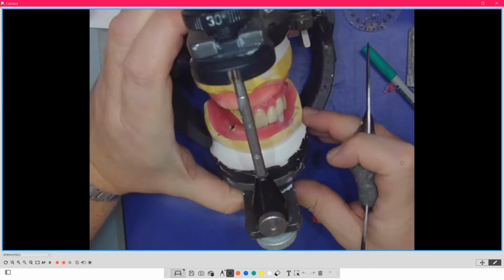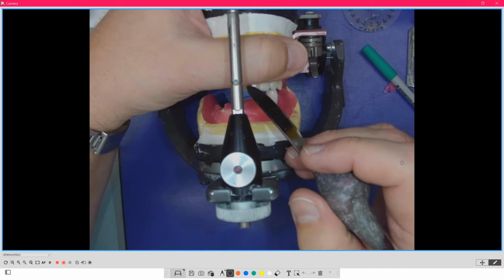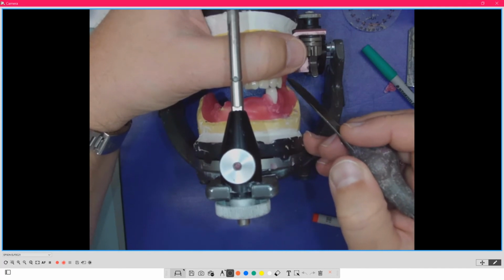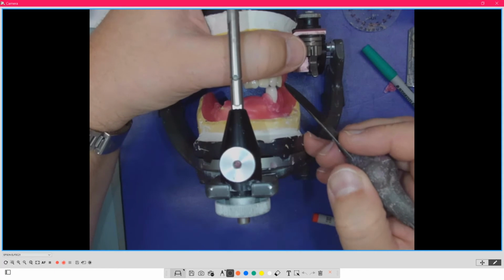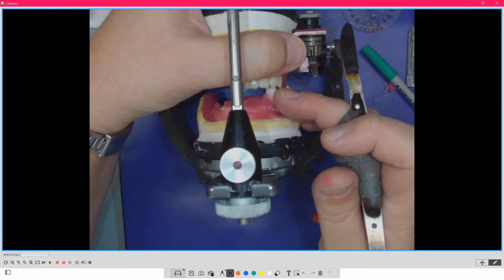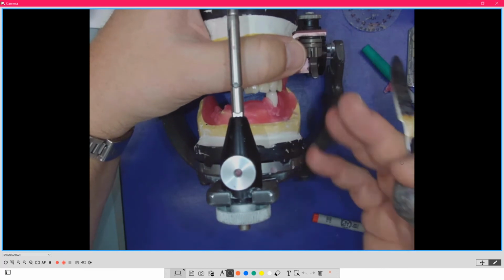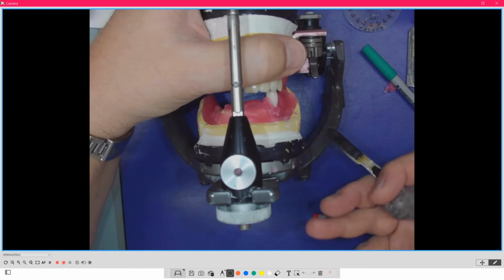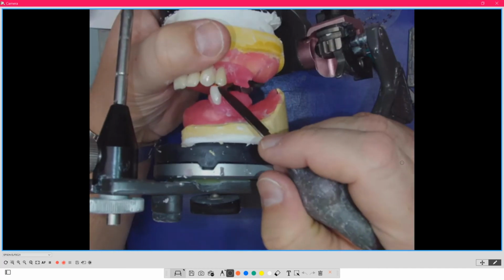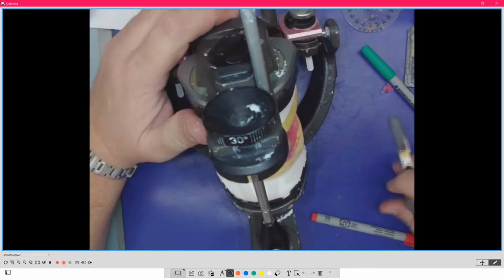But again, behind lips, what you're gonna see is the nice arc of the tooth and the tooth coming through. So you get the smile line and the little triangle by the cheek. So the upper will look good. Because the lower jaw is smaller, it's a little bit more in, so it's compacting itself. So it's gonna fit more within their jawline and their facial features. Yet I still have contact here and proper contact of that cusp coming into the fossa.